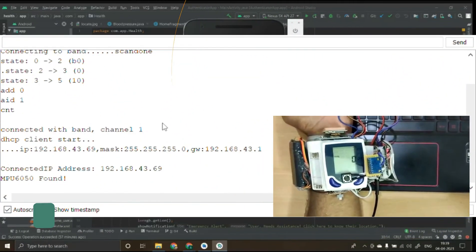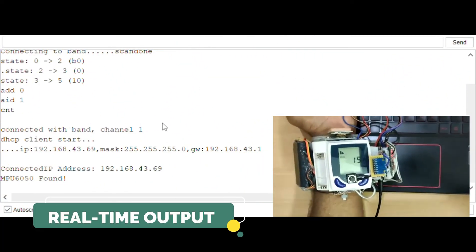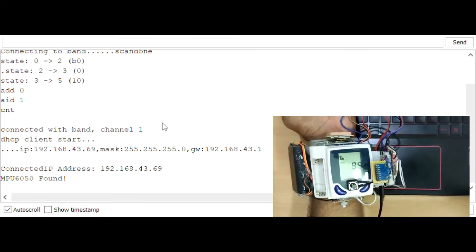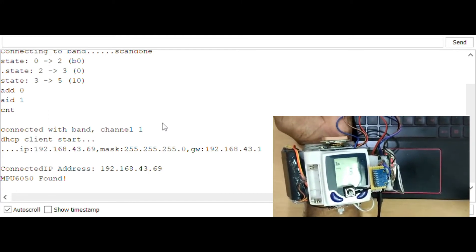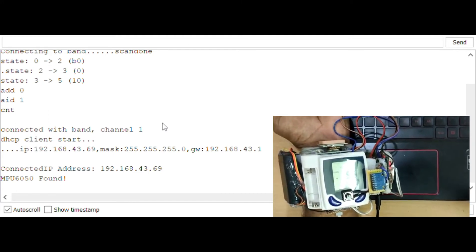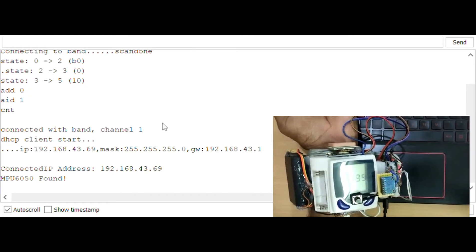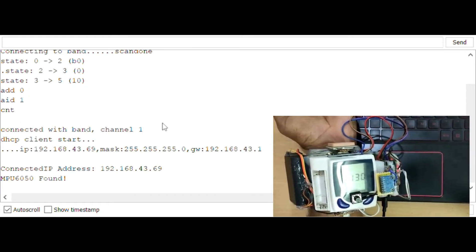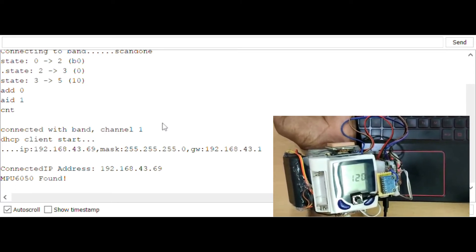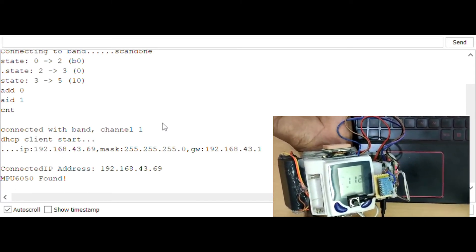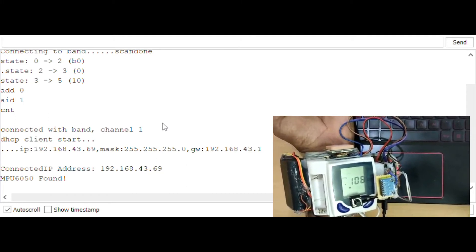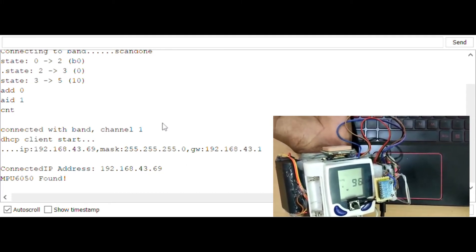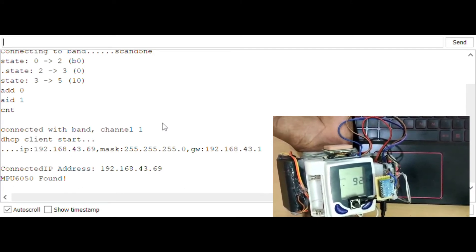The BP sensor records the systolic, diastolic blood pressure and heart rate of the user every 30 seconds and in turn sends it to the Arduino Nano. This Arduino Nano sends the data to the NodeMCU which is connected to a mobile hotspot. The NodeMCU also gets values from GPS sensor and accelerometer. These readings are sent to the Firebase database.